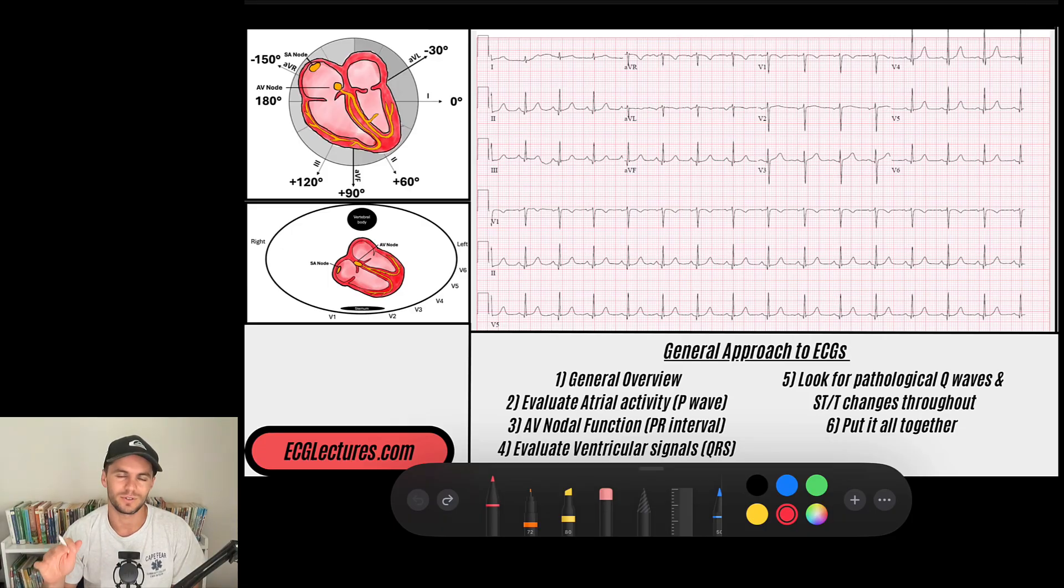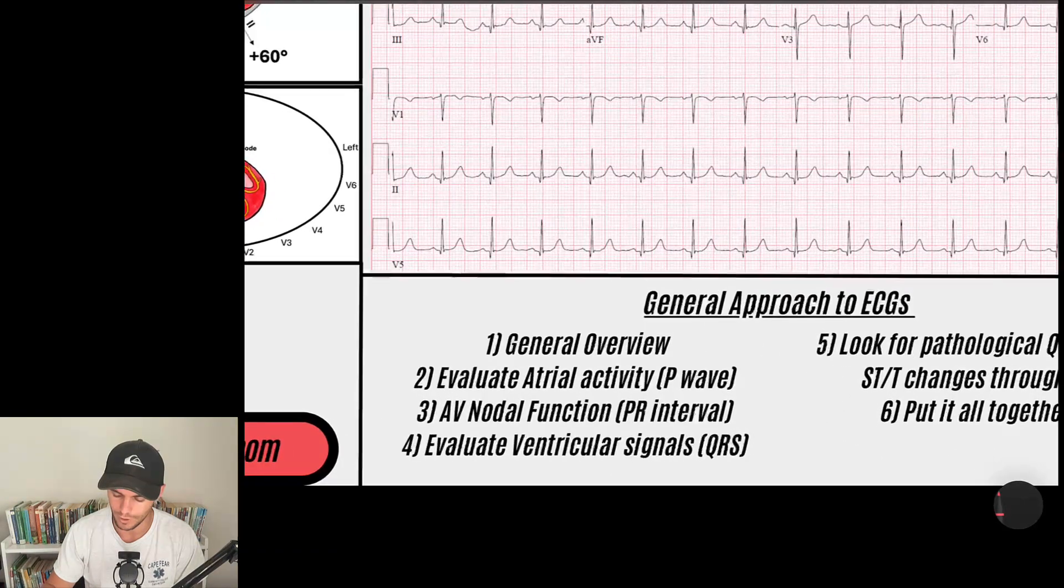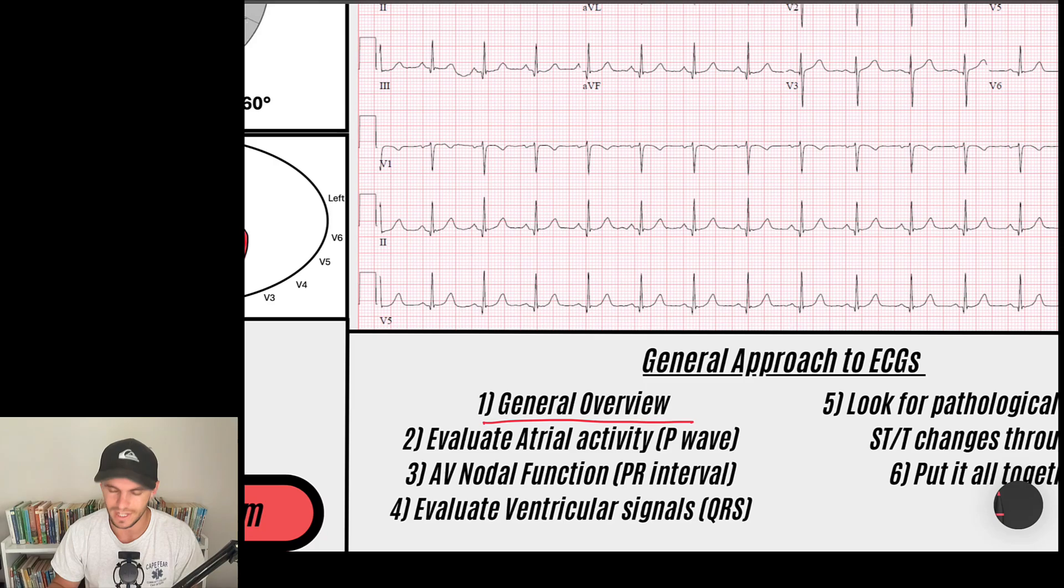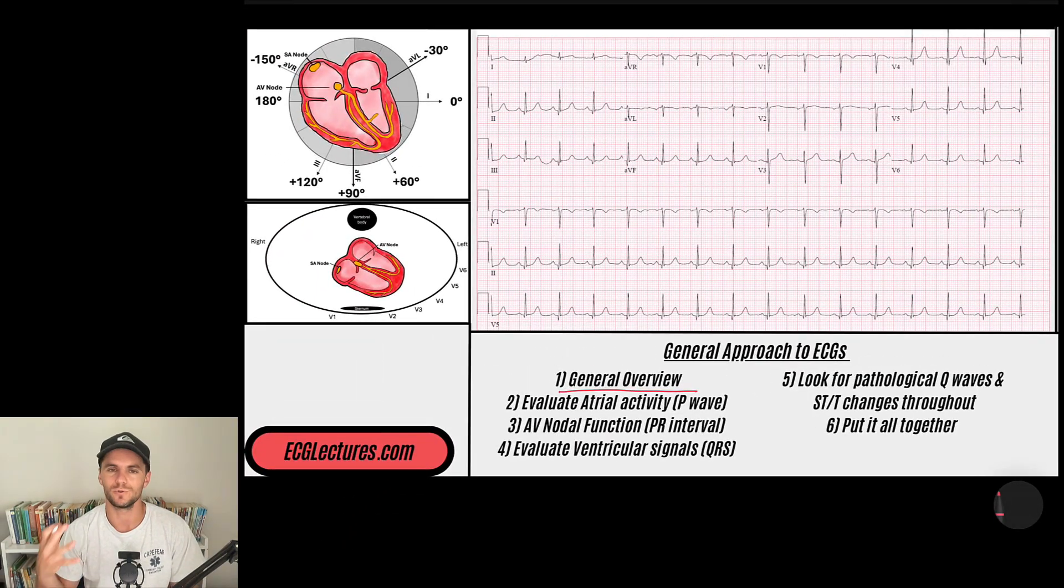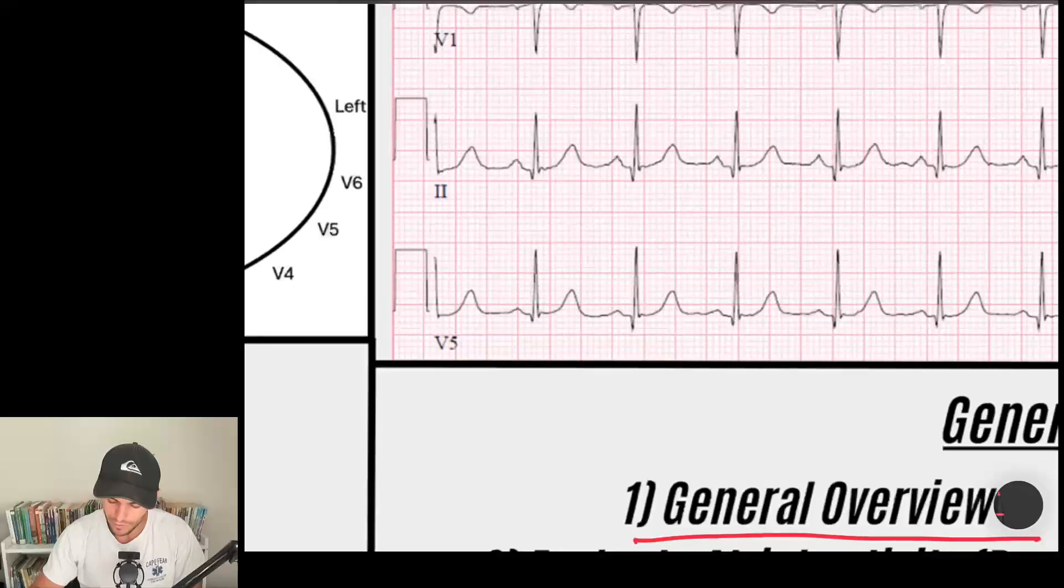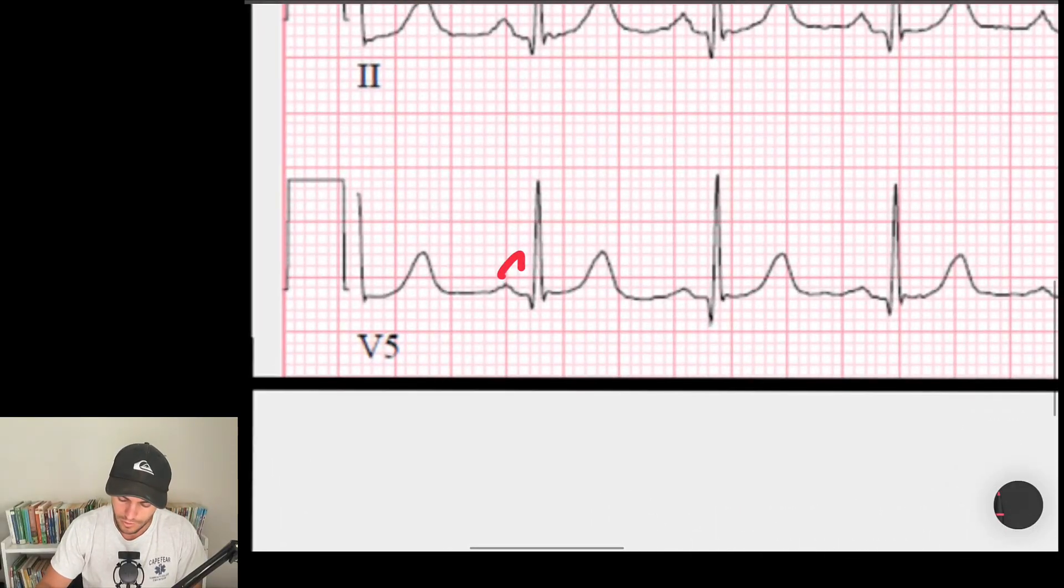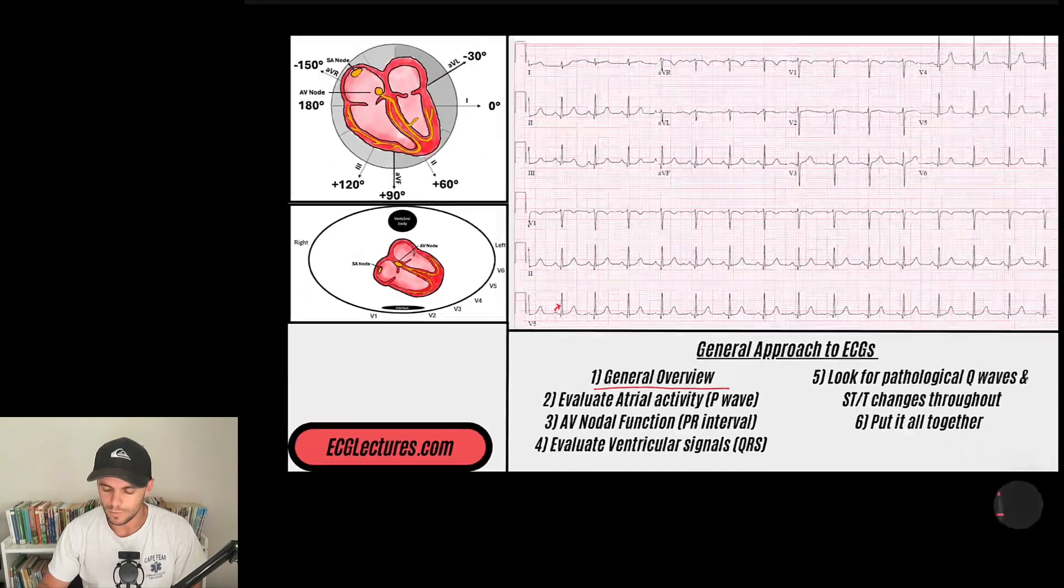As you can see, the six steps are below. We're going to talk through them when it comes to this EKG. Let's jump into it. So step number one is the general overview. What does that mean? That means we need to look at the rhythm, just look at our EKG. Zoom out. Don't get hyper-focused on exactly all these little waveforms, but just zoom out.